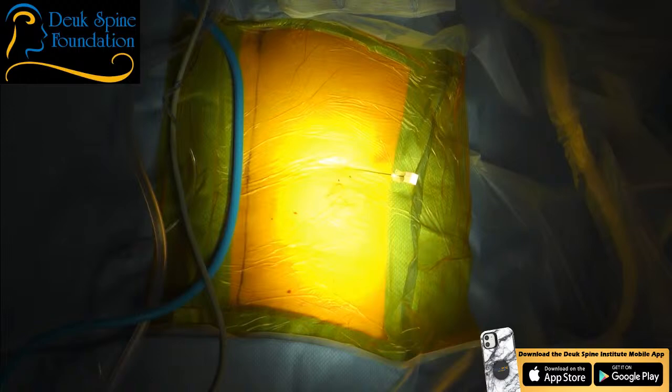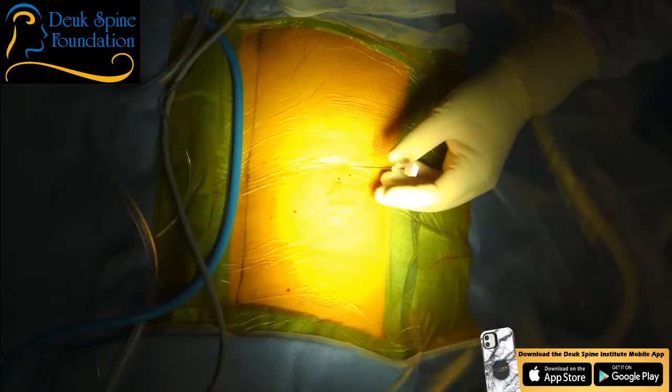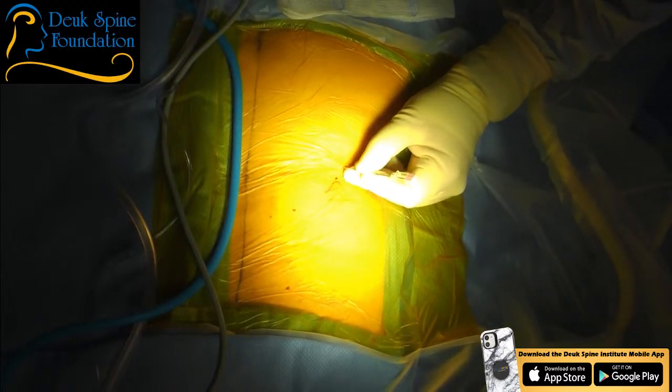And again, it's going to be immensely challenging because of her rotation and her arthritis. I'm just wondering if I can improve that a little bit more. The disc is collapsed at L3-S1. She's doing fantastic. Shot. You're doing great. Everything's okay. This is, if you do endoscopic spine surgery, this is as hard as it gets. It doesn't get any harder.